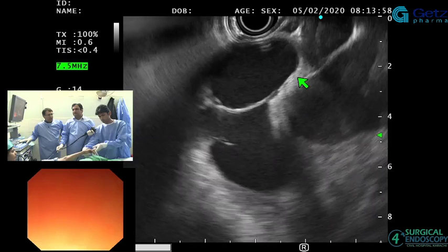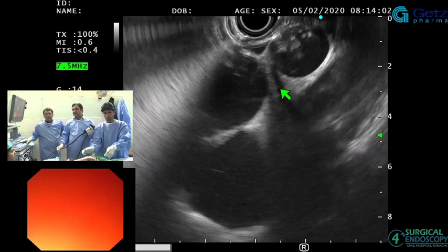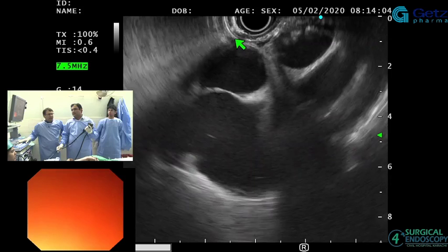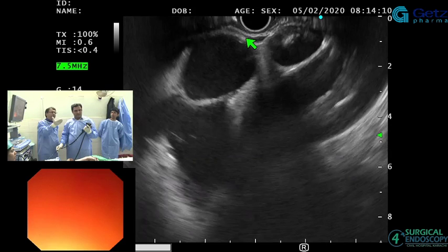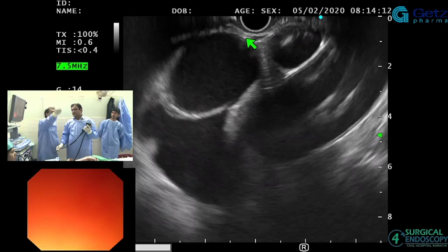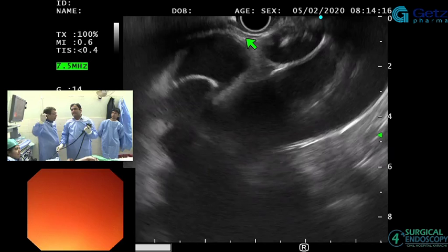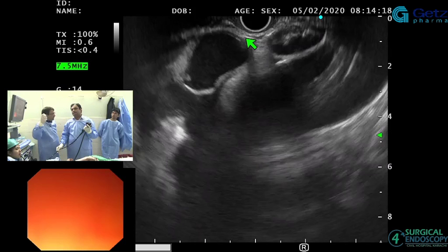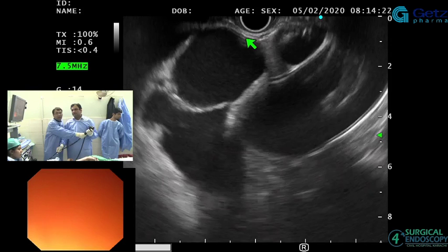Still you're having some air because you're not moving the big wheel towards you. Not moving the big wheel towards you is not going to put the transducer on the wall. That's one thing, that's how the air is coming. Second is keeping a finger on the air button. Now you can do this. You see that? Rotate there, and that's a subcarinal node right there.